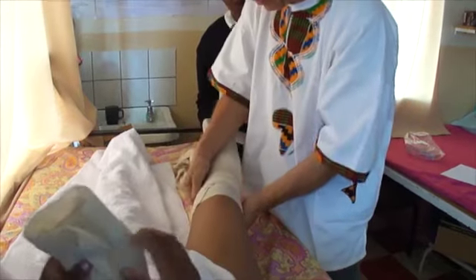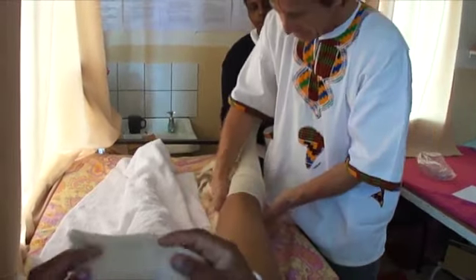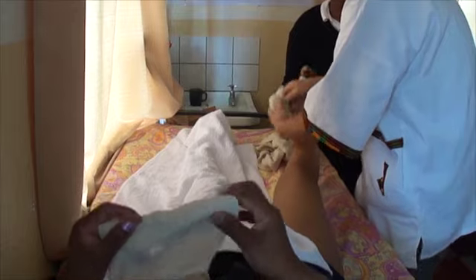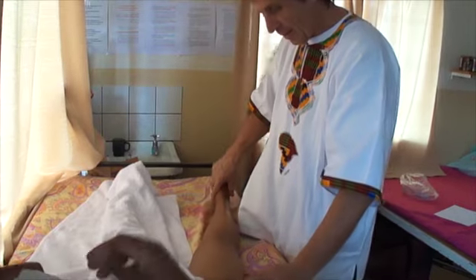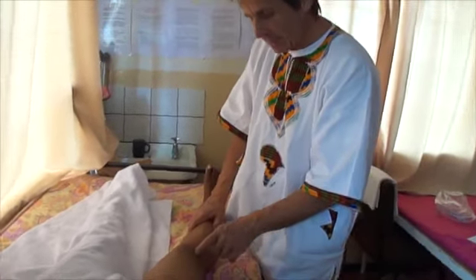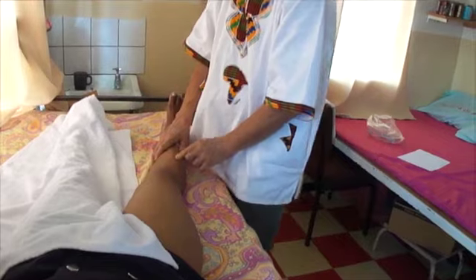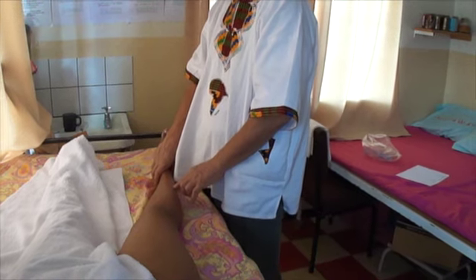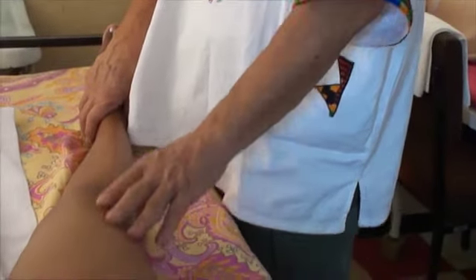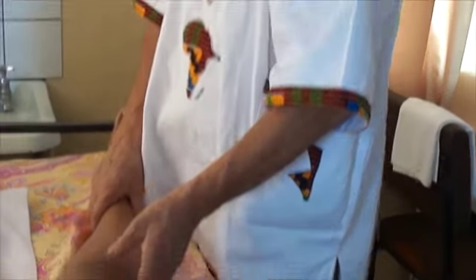It's always good for the patient to roll the bandages. When you have opened the bandages, you will see where the signs are. If you have many signs and there are cushions, you know the bandage was not of regular pressure. Or if you have signs up here but not below, probably you were tying too much up here. Just remember: you can measure the edema, you will see, and then you do it again. Don't worry if you don't succeed on the first go — you will learn it over time.